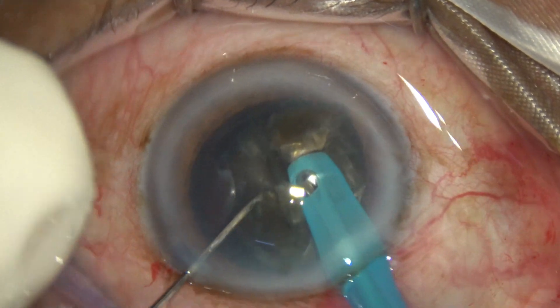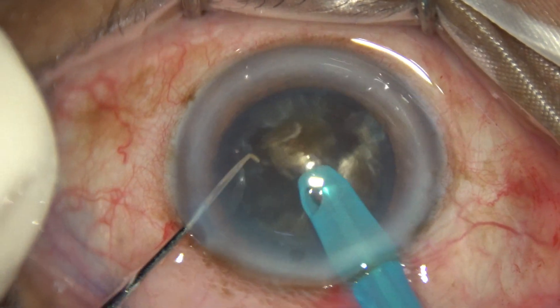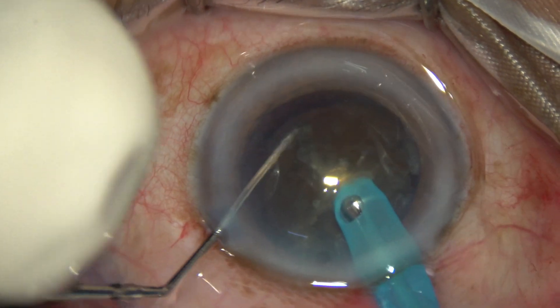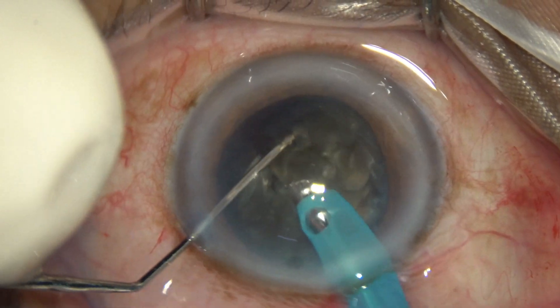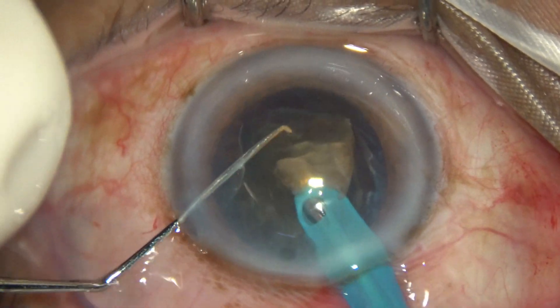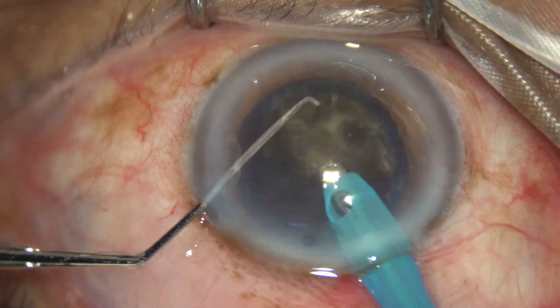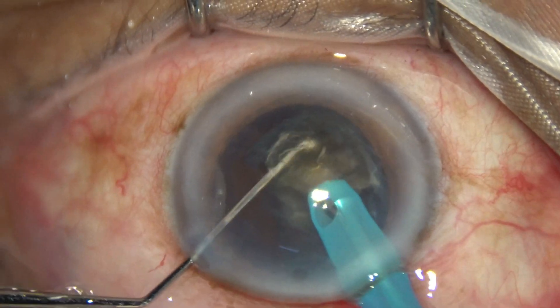The other piece is also divided into smaller pieces and emulsified. The remaining hemi-nucleus is rotated, divided into two large fragments first, and then each fragment is emulsified. Larger fragments can be subdivided into smaller fragments as and when necessary.